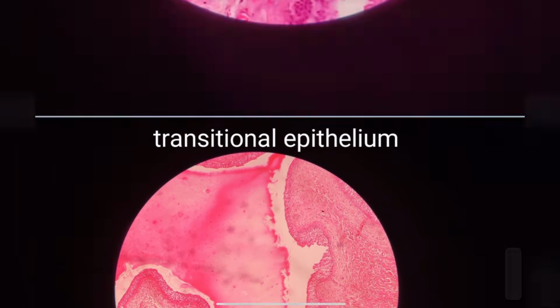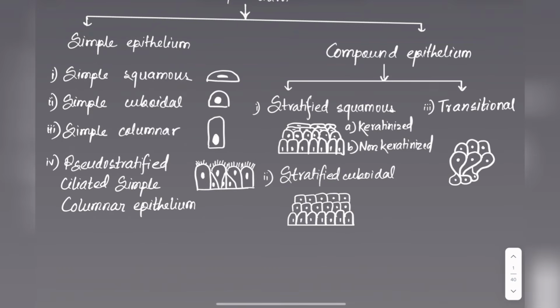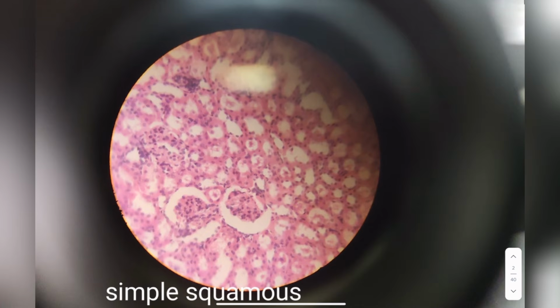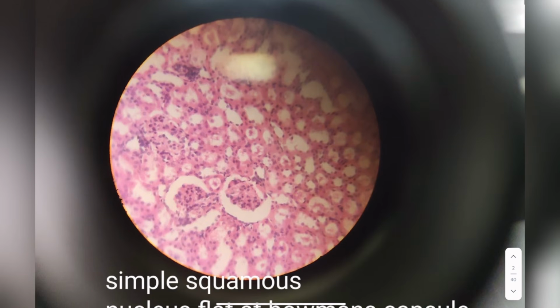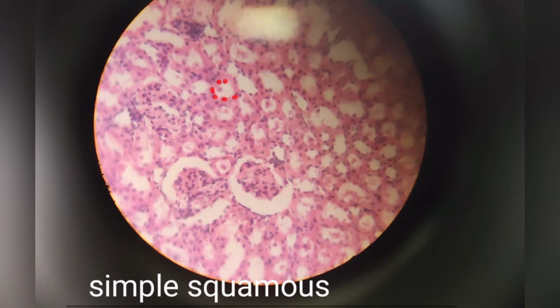So these are all the epithelium that you need to be able to identify for your anatomy practicals. Let's look at all of them one last time. So how will you identify them? First, spaces are present. So it has to be either alveoli or Bowman's capsule. They are lined by simple squamous epithelium. To confirm, look at the cells. These cells are flat and arranged in a single layer. So this is simple squamous epithelium.